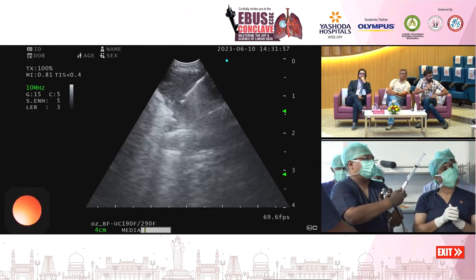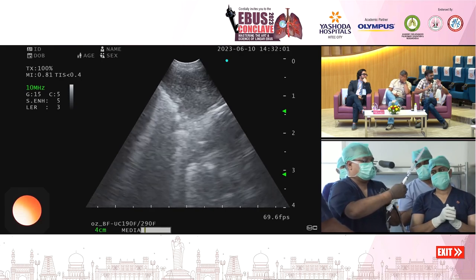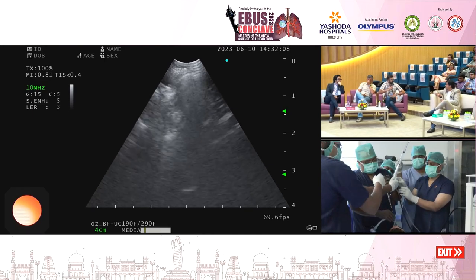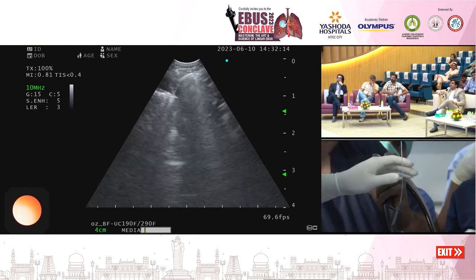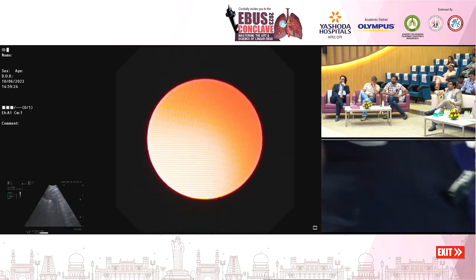5, 6, 7, 8, 9, 10. The use of seeing the echogenic texture of the node is that if there are hypoechoic or dark areas, we can aspirate them. In a case of tuberculosis or something, you might aspirate first, which might be a better sample for microbiology. So we have done about 15 revolutions here. And after that, we have closed the vacuum and taken the needle out.